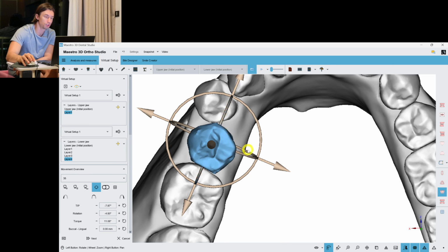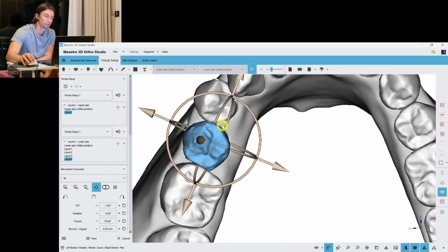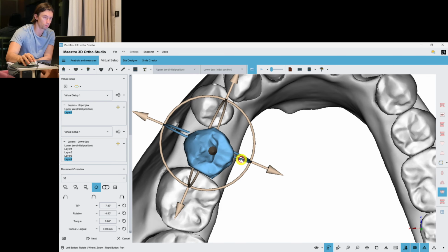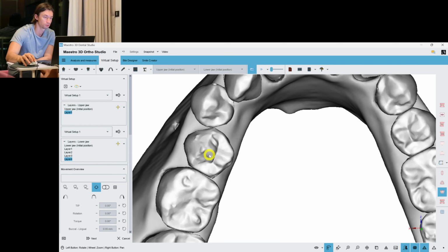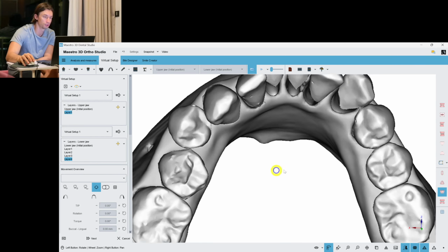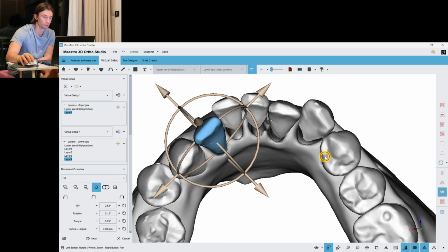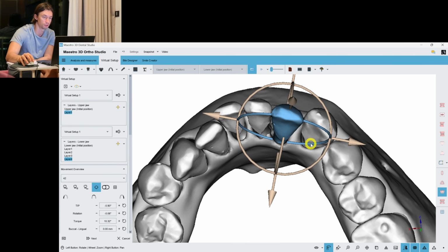So if I do it in one stage, distal tipping and vestibular tipping, there will be like not good direction, not good vector of movement, because there will be an intersection, and we will have to make an IPR for too much, in my opinion. It can be harmful for these teeth. So first of all, we distalize more, and at the layer 5 we are going to move it to the vestibular direction. And yes, some IPR is still needed here.